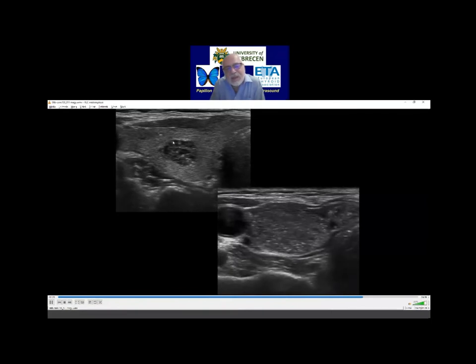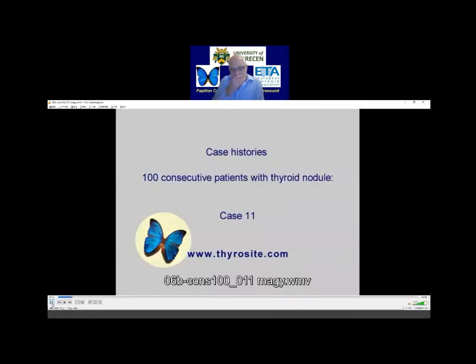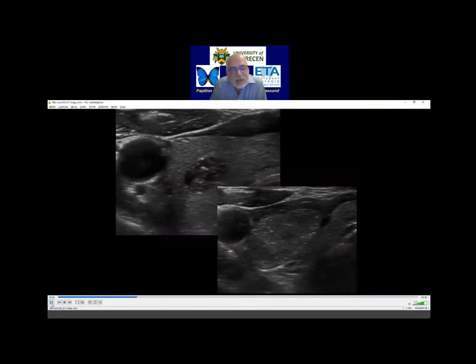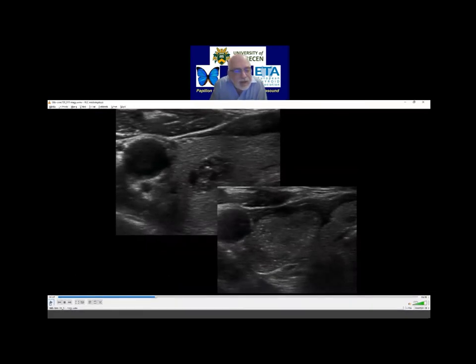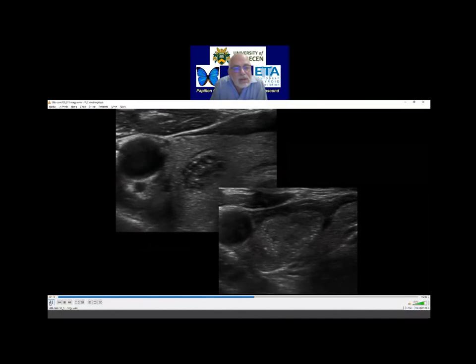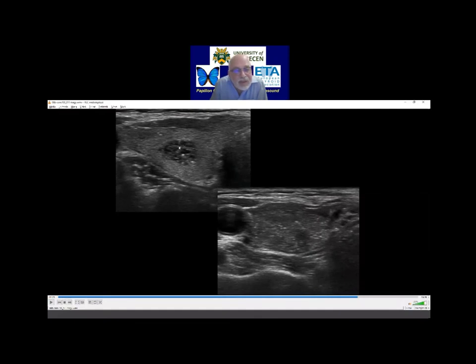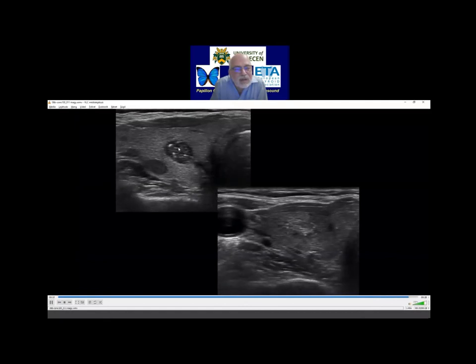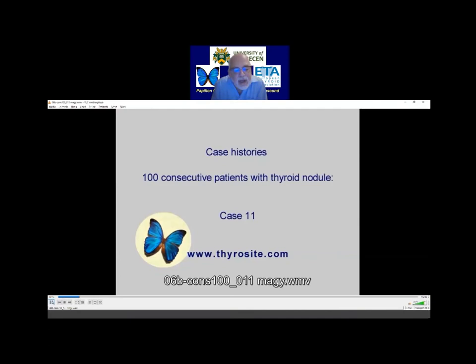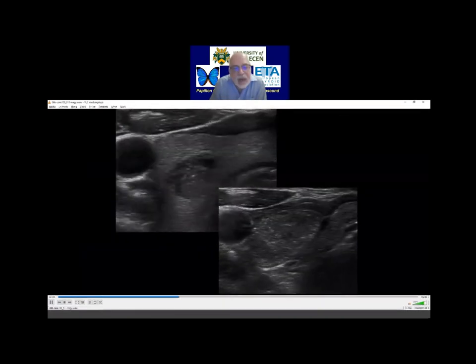You will get an impression by comparing this benign with this malignant nodule. 20 of you stated that this nodule has comet-tail artifacts. I tried to find comet-tail artifacts here. Maybe some figures — for example, this structure could correspond to a dorsal narrowing tail, and here again. So I cannot exclude that this small nodule has comet-tail artifacts, but most of the echogenic figures are clearly backwall ones.